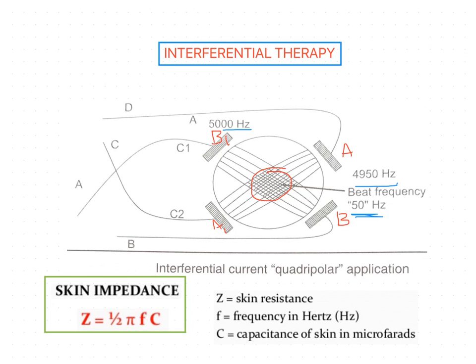And also you can choose the rhythmic type. It has different types, that is 1 to 10 hertz rhythmic. That means in the rhythmic type, from 1 to 10 it slowly increases the frequency to the maximum and again comes back down, from lower to the higher value and again back from higher to lower.